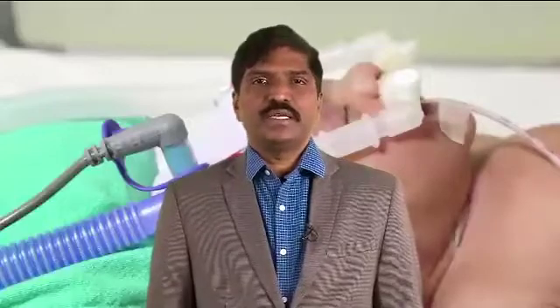To summarize, titration of flow is based on the presence of bubbling in the bubble chamber. FiO2 is titrated to maintain saturations between 90 and 95%. CPAP pressure alteration, that is increasing or decreasing CPAP pressure, is based on the presence of recessions, lung expansion on the chest X-ray and on the target saturations of 90 to 95%. When giving pressure and oxygen, always remember the concept of proportionality. A systematic evaluation is always required before confirming CPAP failure in any newborn.